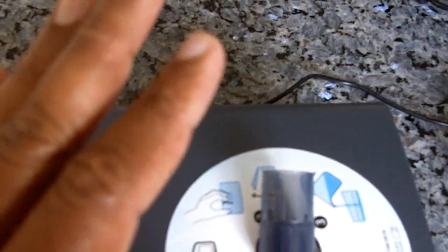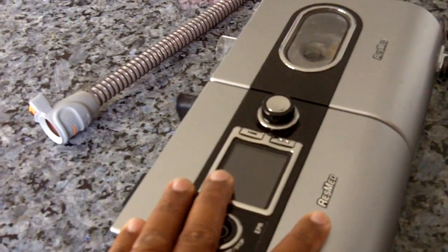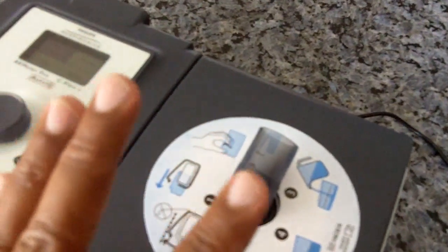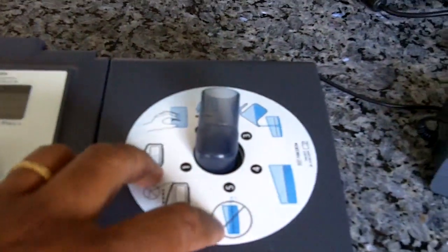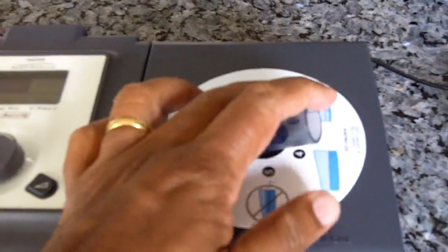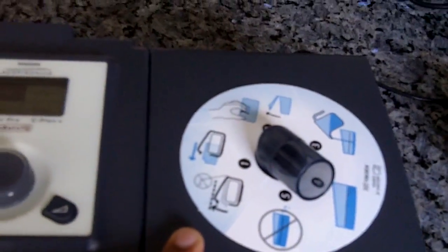Okay. Do I think it's as powerful or as effective as the ResMed? Not necessarily. I don't think so. But this thing does work. I think it works a little too much. A lot of people who need a lot of humidification will find that if they use it at the System One setting, you will not get much moisture.